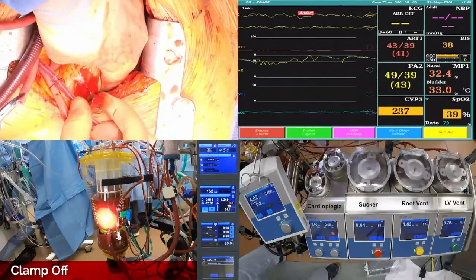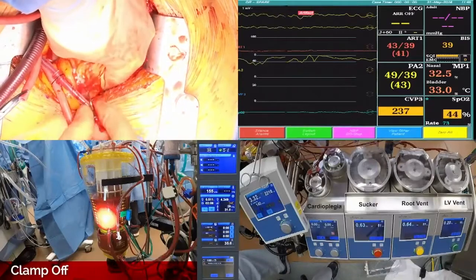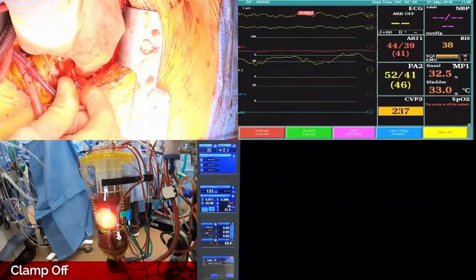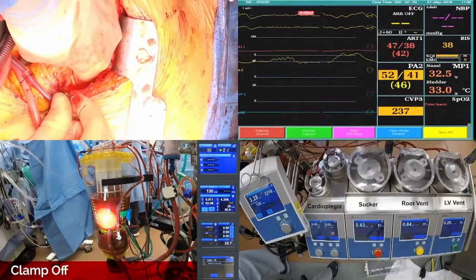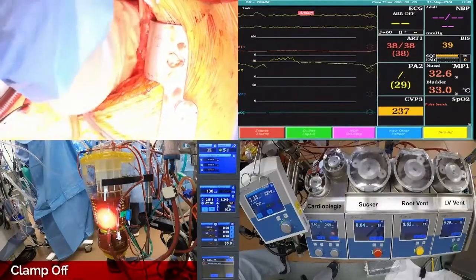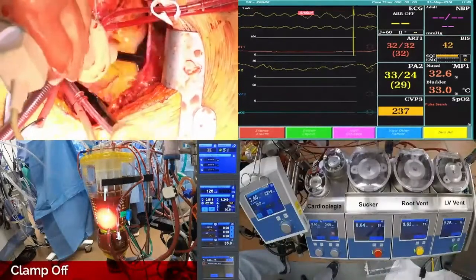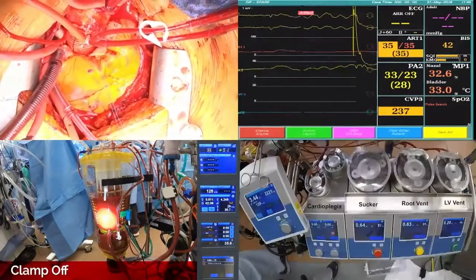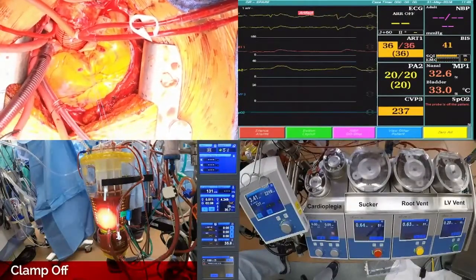So you just stab a needle right into the left ventricle. Yeah. And I noticed you don't have to suture that. Okay, so another technical thing: go in, angle it, go another direction, change your angle again, go in. So the hole you create is a zigzag path through the heart, even though it's a straight needle. And when you pull it out, all those layers fold over each other. Oh, really? If you stick it straight in the heart, then it's more likely to bleed. Huh. Okay. That's pretty cool. That's a good idea.